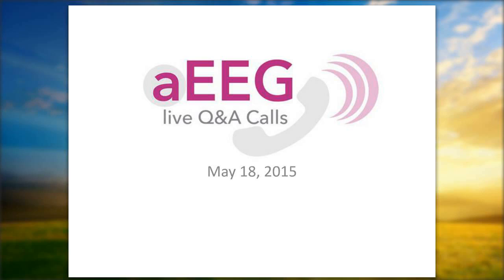two channels. Maybe I'll do this on another call, but I think there are really some primary benefits. One is being able to compare activity, specifically symmetry, which we are going to talk about today. The other is the ability to identify more focal events. You might have a seizure that's arising more from one side, and that ability to localize a little bit is probably the biggest benefit of having two channels. Although I know it's more effort than just putting on a single pair, at least two channels is my preference.